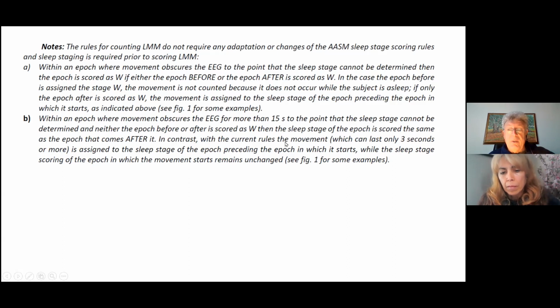In contrast with the current rules, the movement, which can last only 3 seconds or more, is assigned to the sleep stage of the epoch preceding the epoch in which it starts. So while the epoch is scored according to the epoch that comes after, the movement is assigned to the stage of the epoch preceding it.